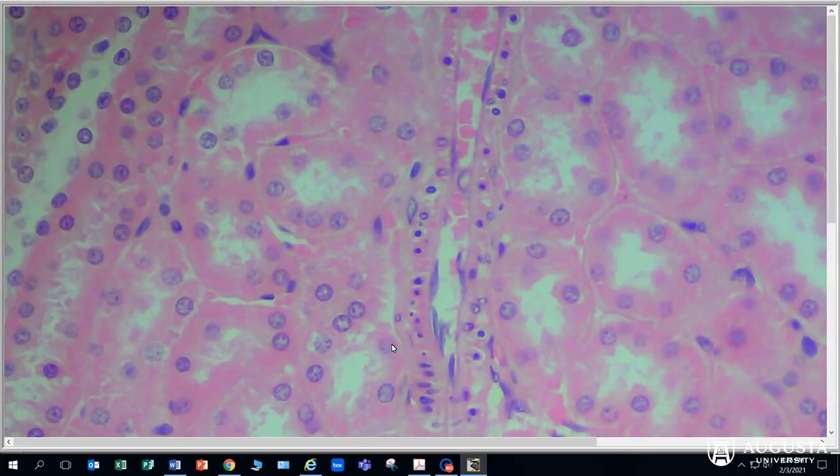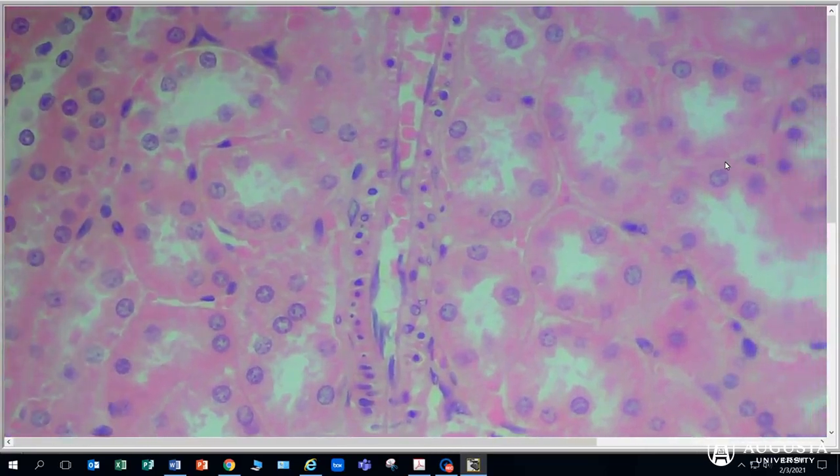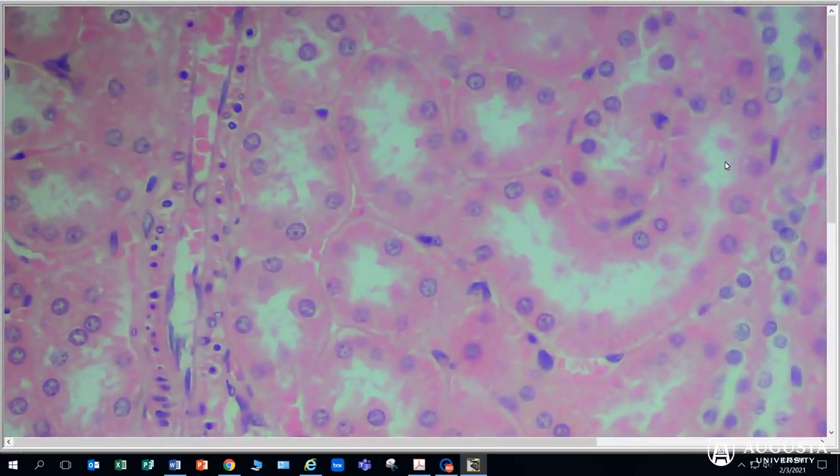Now we can see that we have all of these different tube structures. So let's pick this one right here. If you were to look down a straw, or a box of straws, from the end, you would see very circular structures. So here we have a kidney tubule, and the line of that kidney tubule, here is the opening, which is the apical space of this simple cuboidal epithelium.